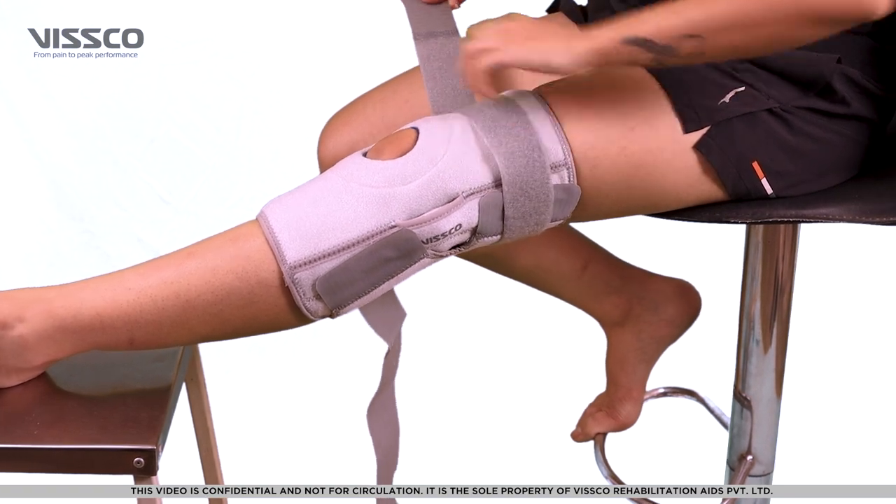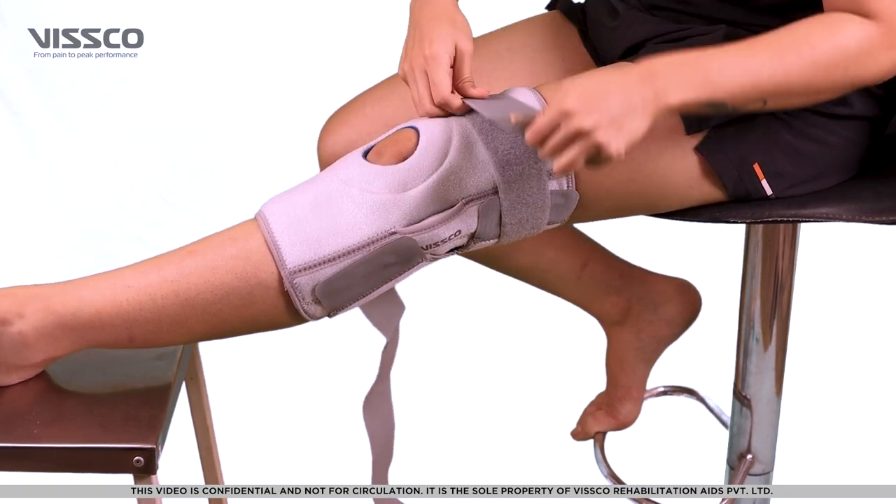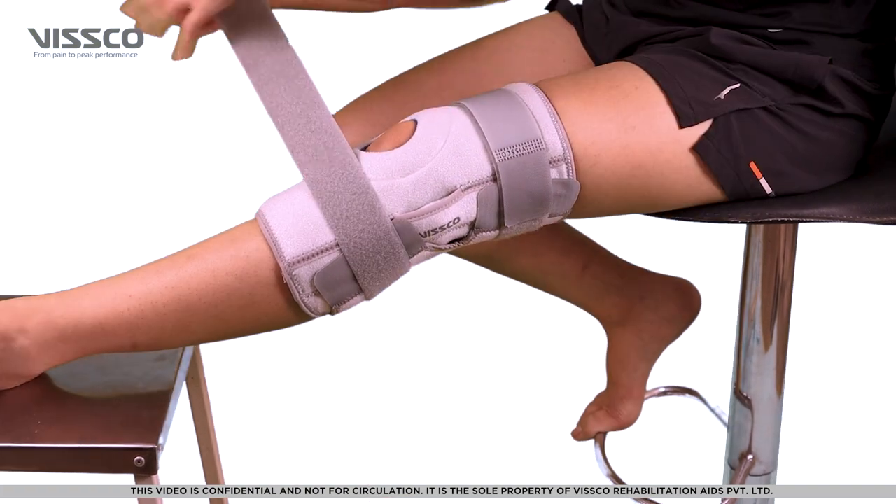Lastly, place the horizontal straps through the buckles and lock for additional reinforcement.